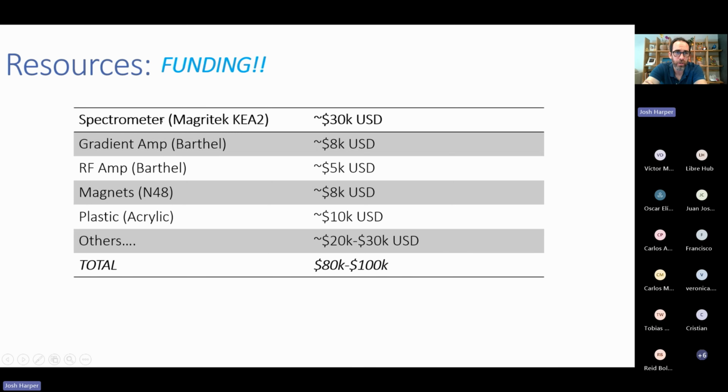If you do choose to go with the Red Pitaya spectrometer, that drops down to a few $1,000s, I think, but you do have to buy a few extra electronics. So maybe you go from a $30,000 spectrometer system to $4,000 or $5,000 in the end after the other additional things you need to buy.